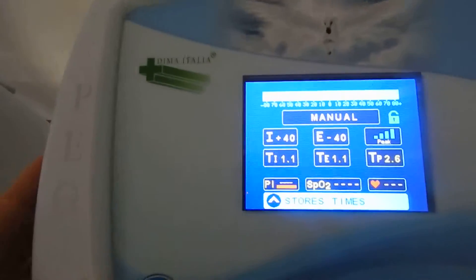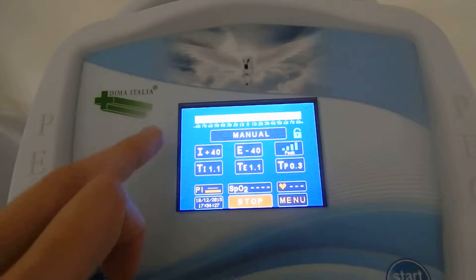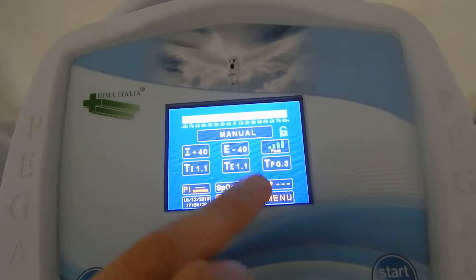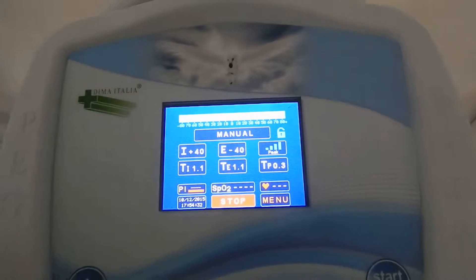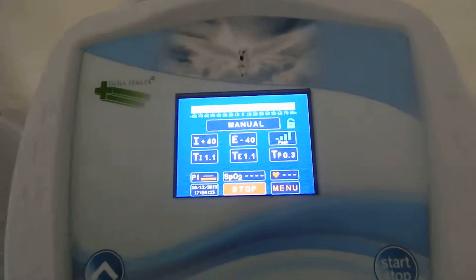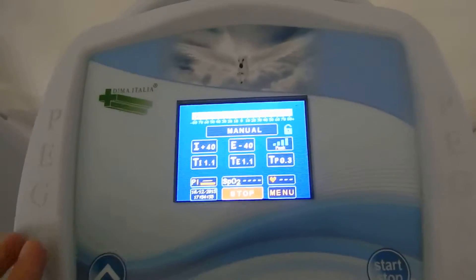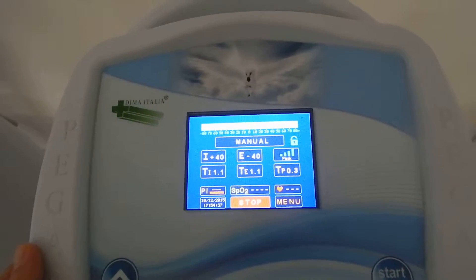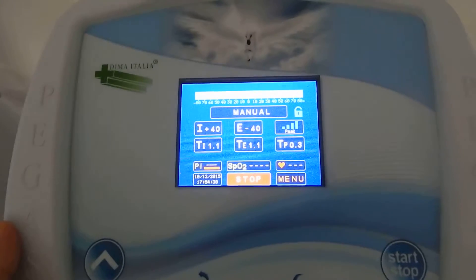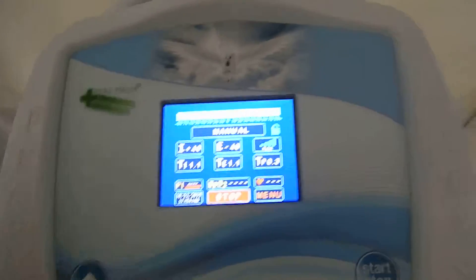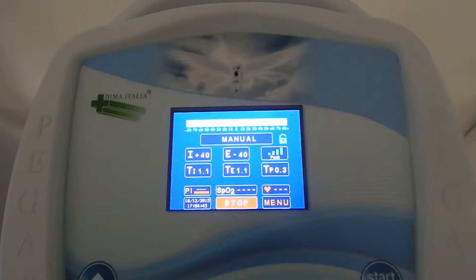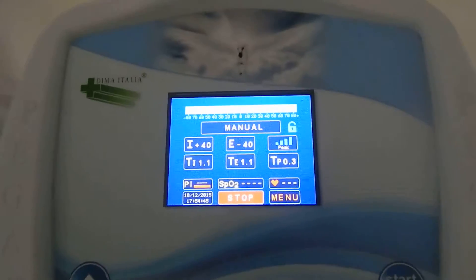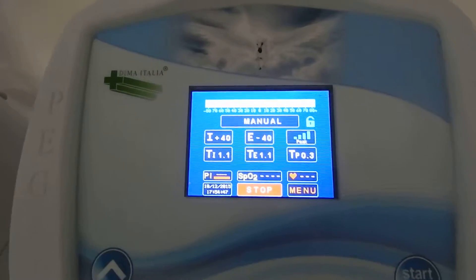By pressing the key up, all the values will be stored in the device and they will appear in the other modes, such as automatic, easy start, or auto sync. So the therapies that the physician has decided for the patient will be available also in other modes.